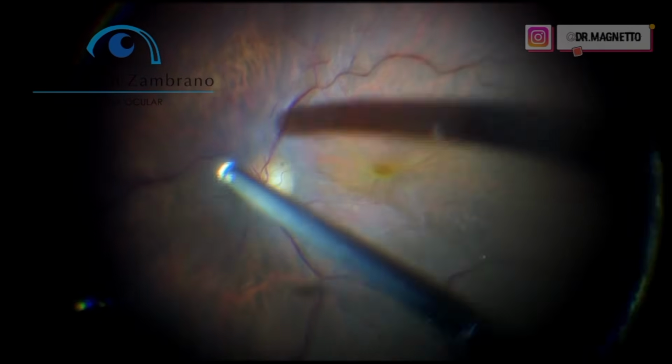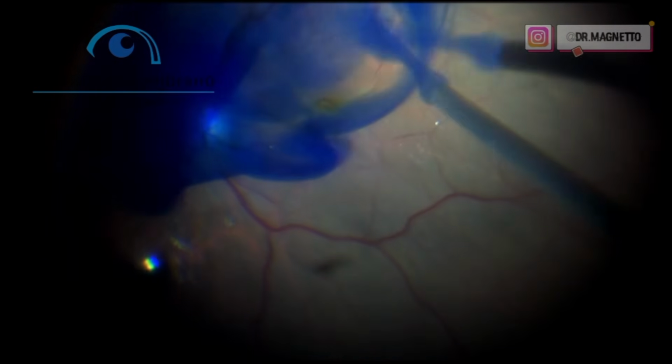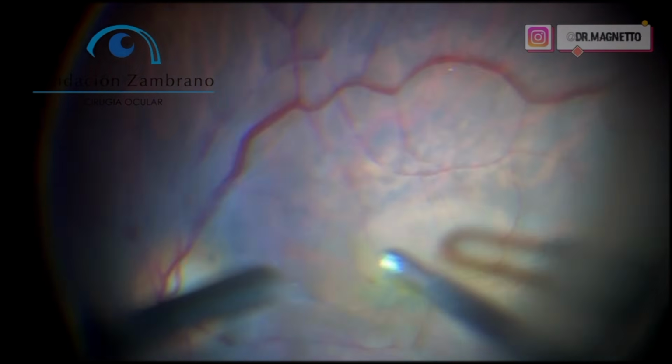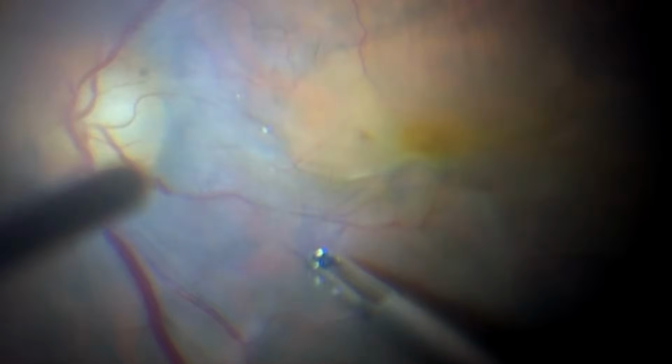With the vitreous detached, he performs a complete vitrectomy with shaving of the vitreous base and finishes with an internal limiting membrane peel after staining with brilliant blue dye. Ideally, it is important to preserve the internal limiting membrane over the fovea in these cases, to avoid damage to the center of the macula.